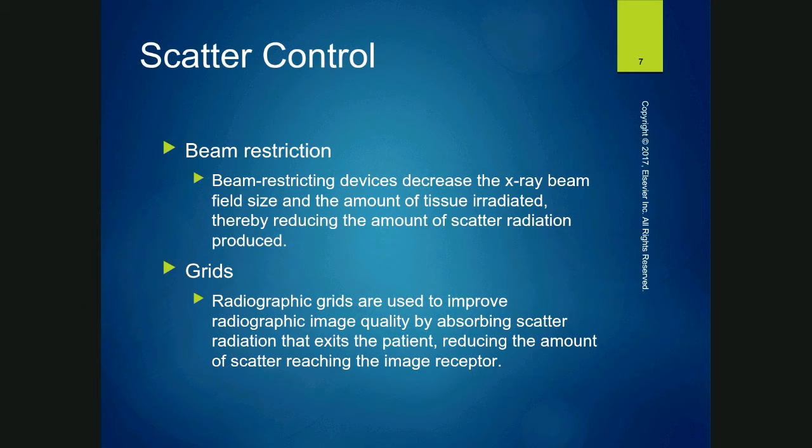No, these are not good things to happen. We don't want to have scatter. We don't want to have decreased visibility of our structures, right? Because remember, contrast and brightness fall under the visibility of structures whenever we talk about radiographic quality. So what are we going to do about it? Throw our hands up in the air and be like, I don't know? No, man, we got things we can do.